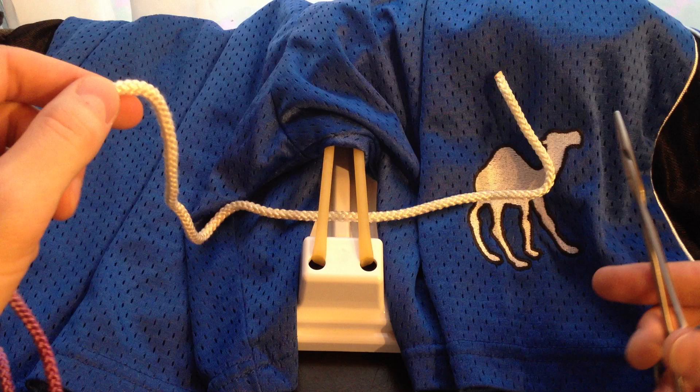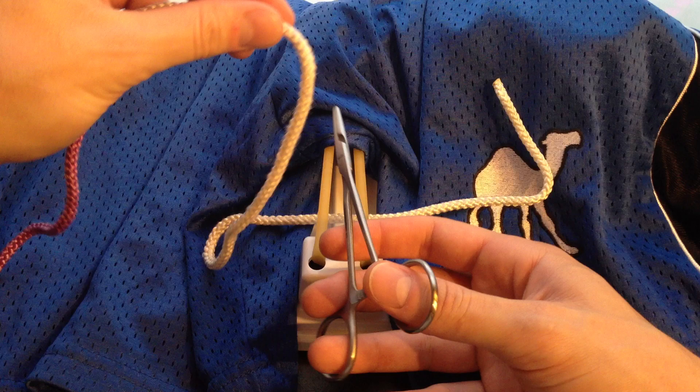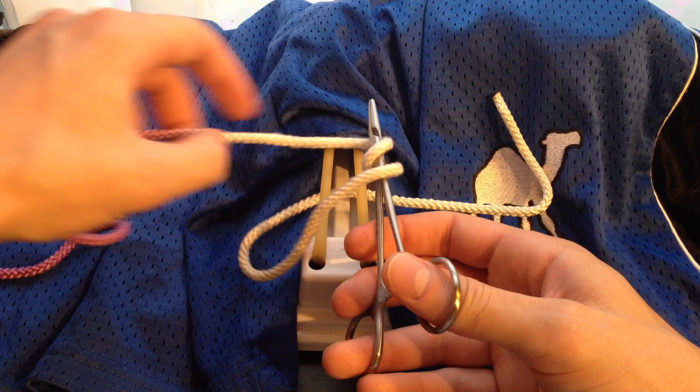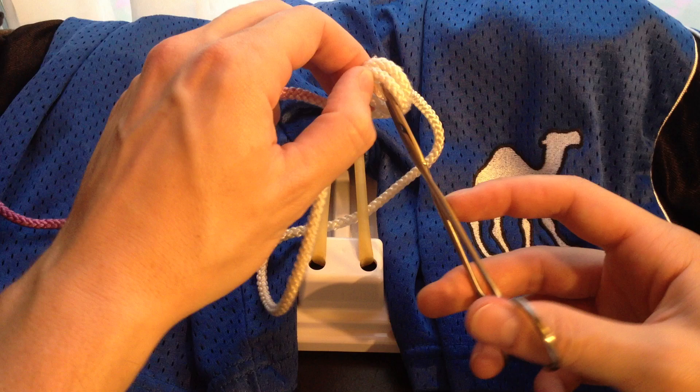And you're going to hold on to this longer end with your left hand. When you tie your knots, you're always going to start with your needle driver laying right on top of the incision, parallel to the incision. For the first knot, you're going to take the long end and wrap it twice around the needle driver. You can see we've got two loops. You're going to grab the free end as close to the tip as possible — this makes it easier to pull through the loops you just created. I'm tying this with thicker strings so you can see.